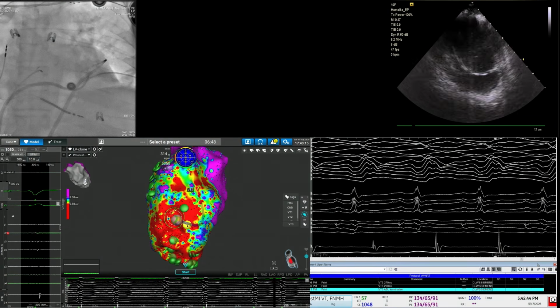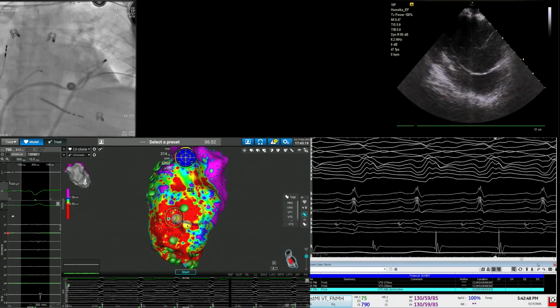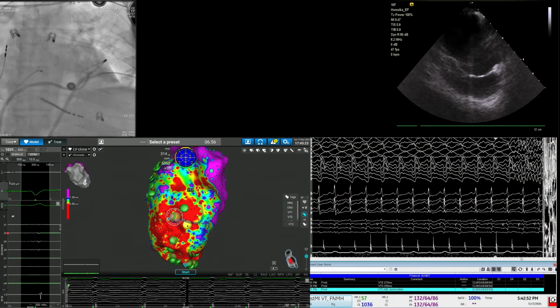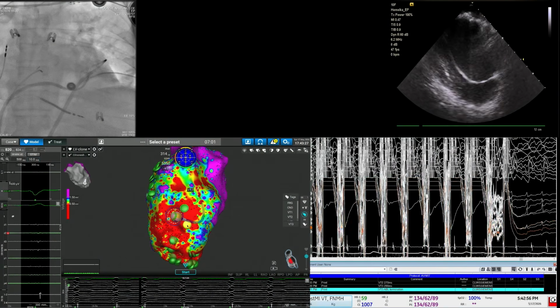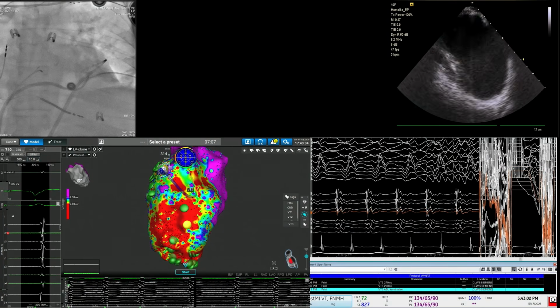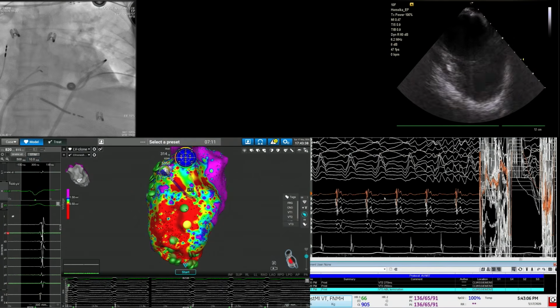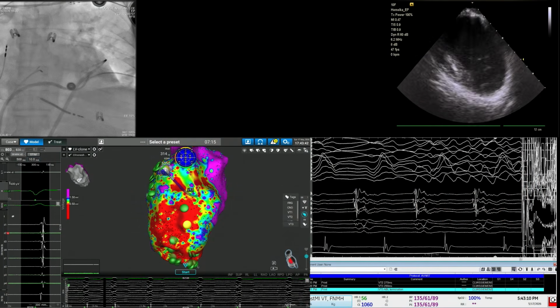We had enough blood pressure that we decided to go ahead and try to map and ablate. So we can drop the sweep speed. When we started ablating, actually we ablated at a different location, a little bit higher up, the green dot that you're seeing on the top next to the ablation catheter. And when we ablated there, you can see we didn't do much, right? Is this the first one? Yeah. Show the electrogram there too at 200 sweep speed, and go to the right before the noise starts.